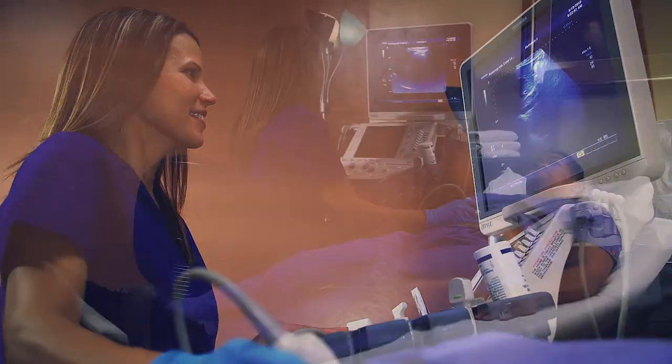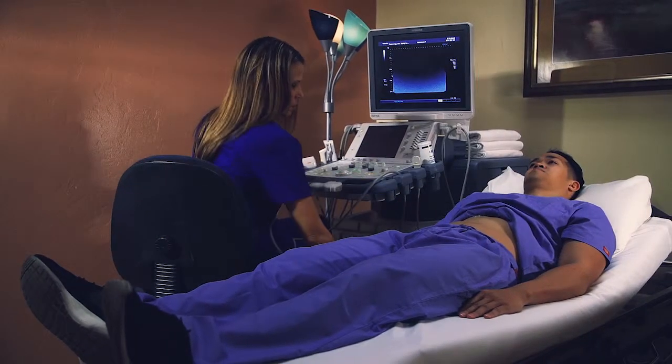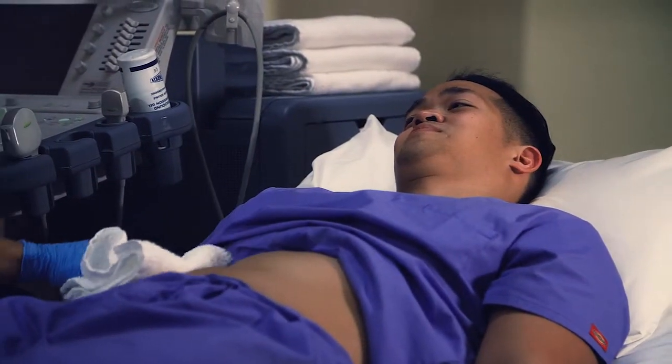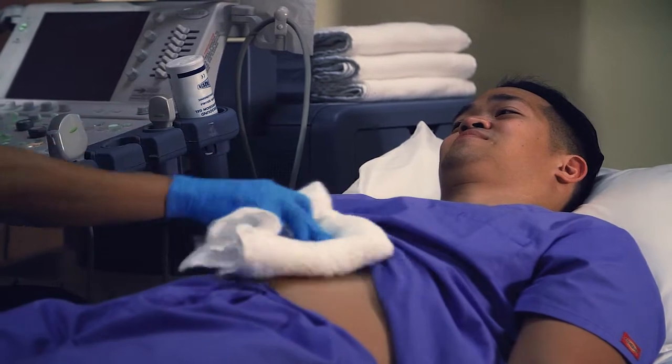Ultrasound can detect diseased or damaged tissues, locate abnormal growths, and identify a wide variety of conditions, enabling your radiologist to make a quick and accurate diagnosis.